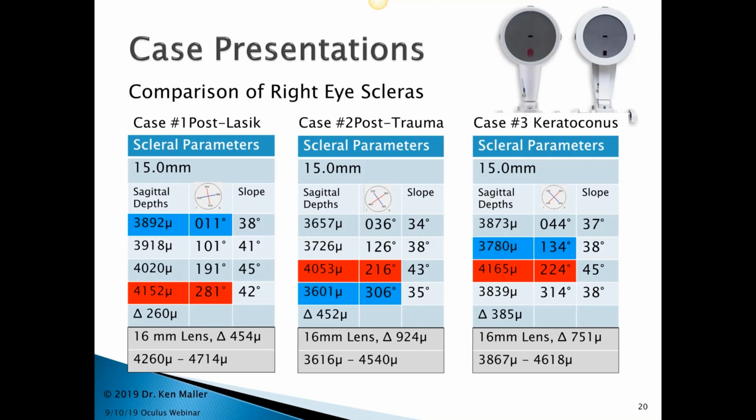The reflected data, anyone who's done any Placido disc-based topography who is reliant on reflected data already understands where that can create a problem if you have tear film that is inadequate, poor quality, or just has junk and debris floating by.